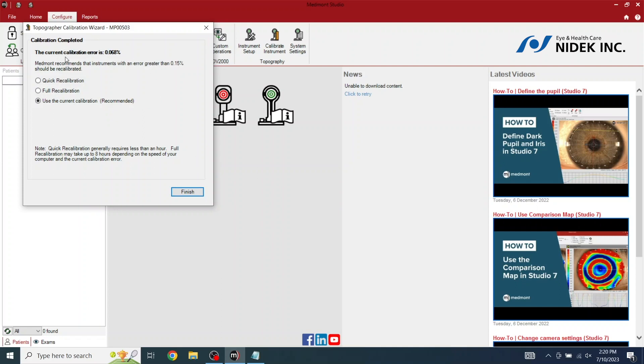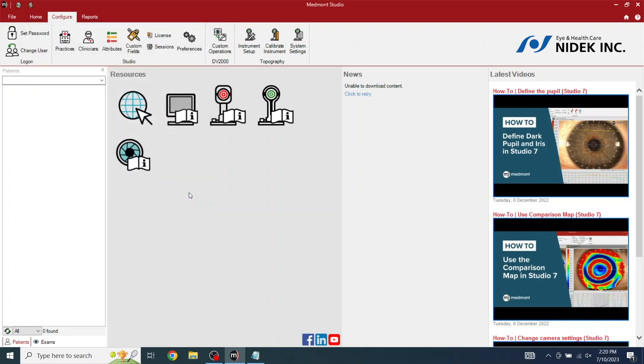As you can see, the current calibration error is 0.063%. Medmont recommends that instruments with an error greater than 0.25% should be recalibrated. Here within the parameter, we will select finish.